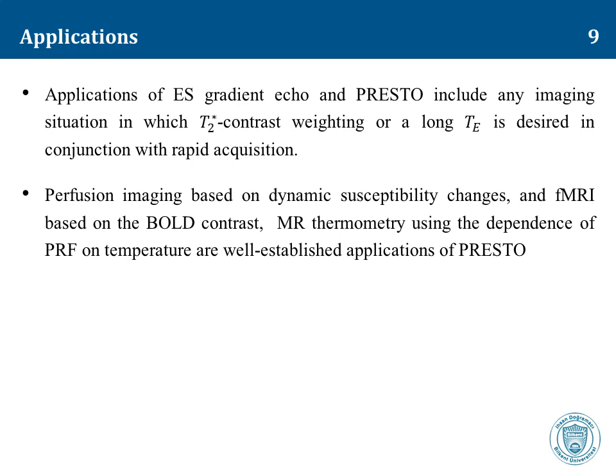PRF methods calculate a temperature difference map by forming a phase difference image based on acquisitions obtained at two different temperatures.